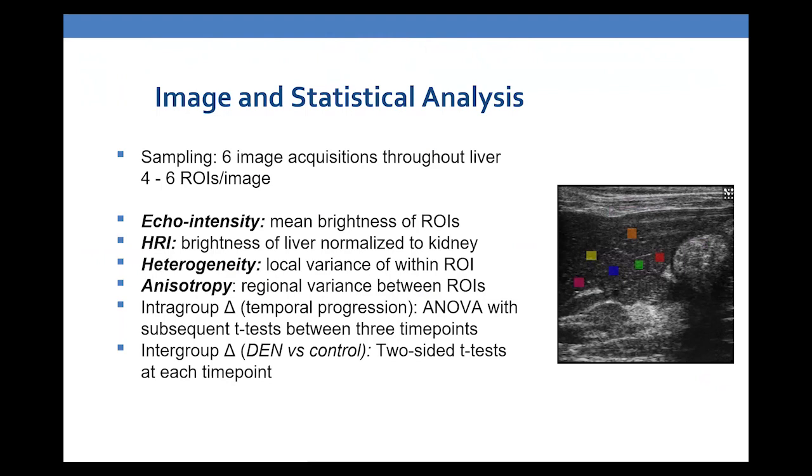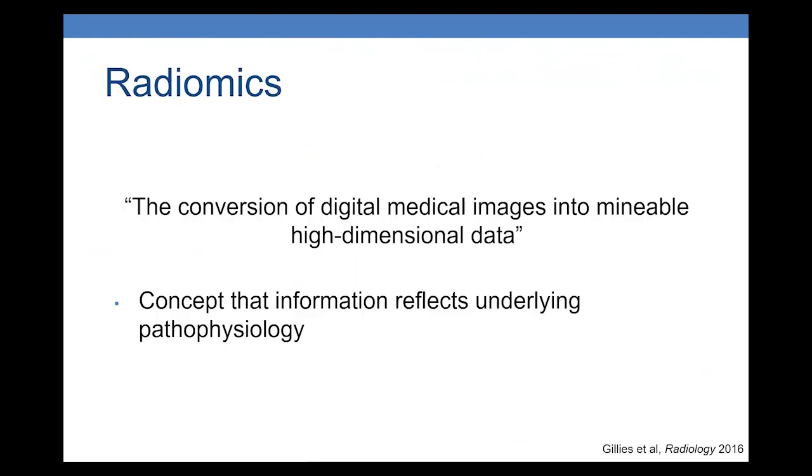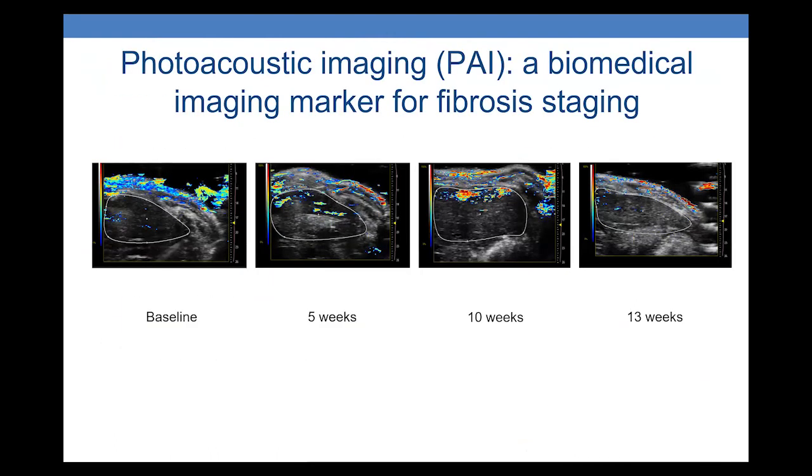And for the photoacoustic aspect of things, what do you envision the result being? Do you expect that that data will be used to complement the data in other modes? Yeah, exactly. So to complement, we have to correlate it first with the fibrosis changes we saw, histologically first, and also with our grayscale findings as well. But if it holds true, it can be an individual, a separate biomarker.